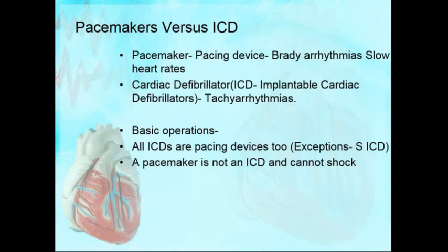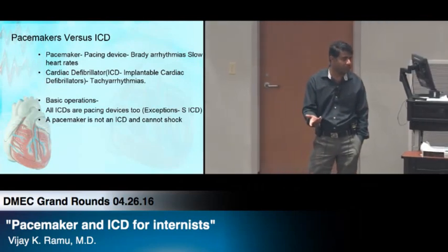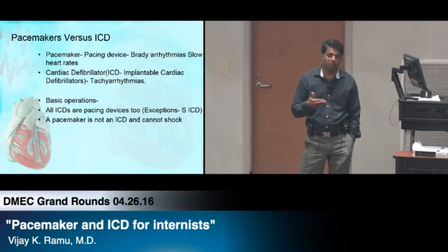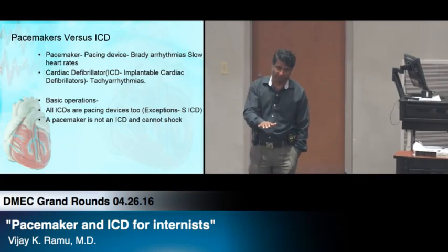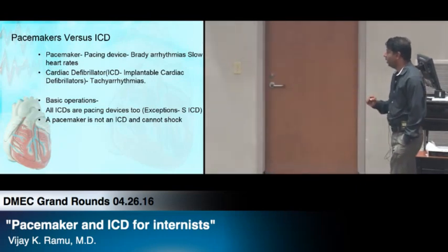There's a lot of reasons why you don't do both. One is probably the expense part of it. It's a bigger can, the devices are different, the lead is different, the leads are thick, it comes with its own complication. And pacemakers are a whole lot cheaper than defibrillators. So cost-effective wise, if somebody does not meet a defibrillator indication, he just gets a pacemaker. So that's where there's a lot of things going on in that direction.